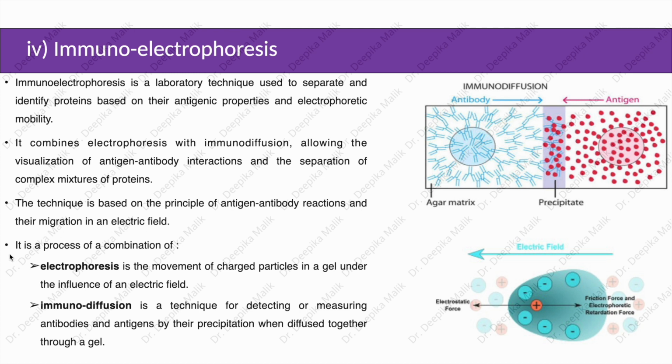It is a process of combination of electrophoresis, which is the movement of charged particles in a gel under the influence of an electric field, and immunodiffusion, which is a technique for detecting or measuring antibodies and antigens by their precipitation when diffused together through a gel.